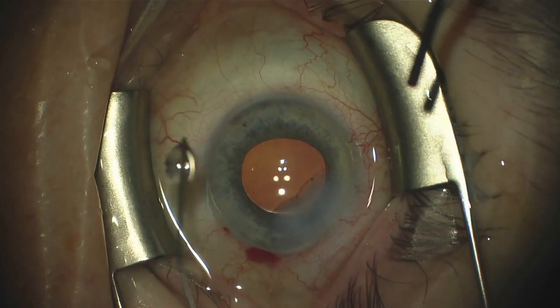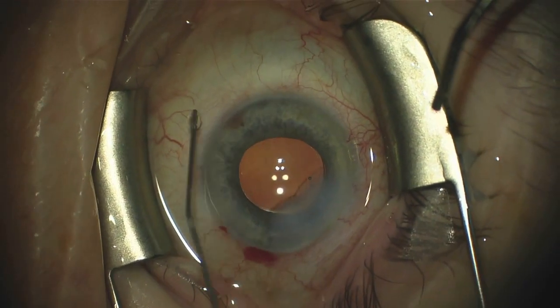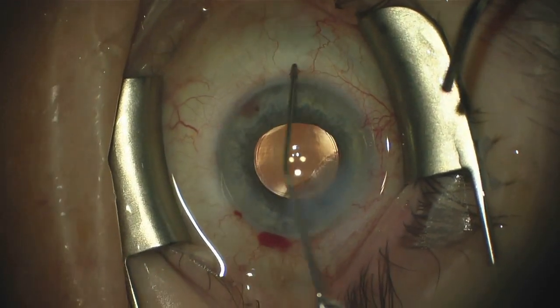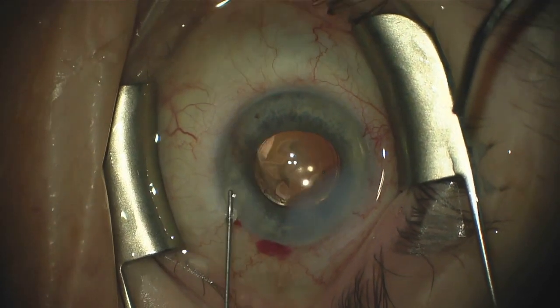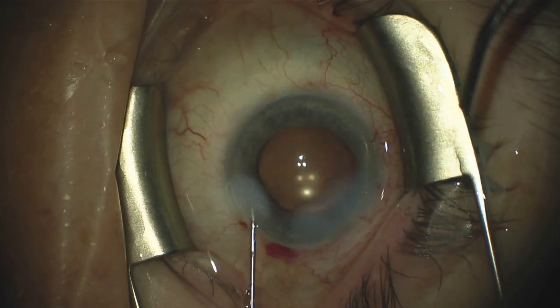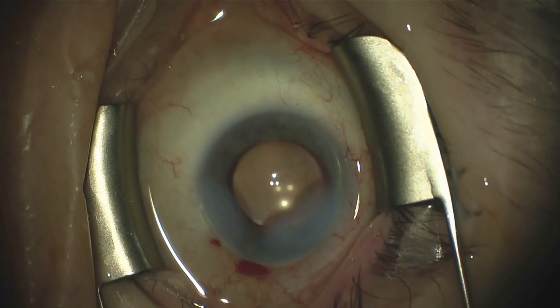Once the pressure drops a little bit in the eye, you can see how the episcleral venous plexus fills up and re-engorges with blood. And then as we increase the pressure in the eye, you have one of the most beautiful blanchings I've seen with the procedure. It really illustrates how you're treating all sites of resistance to outflow with the streamlined procedure.